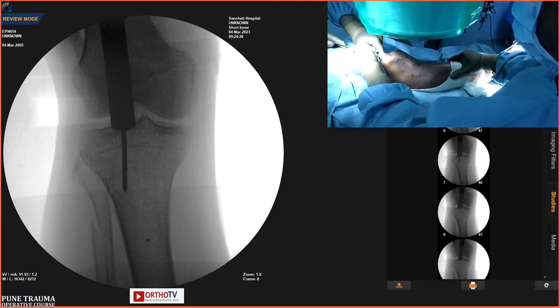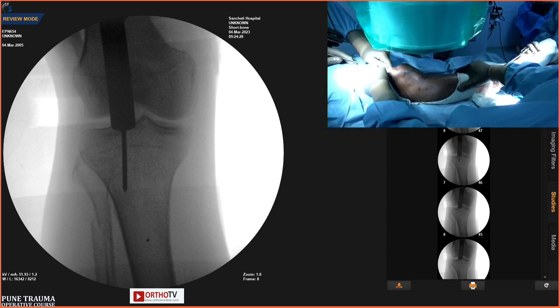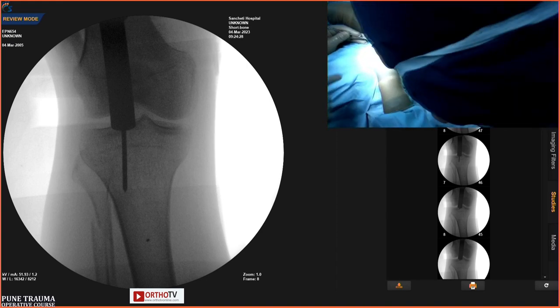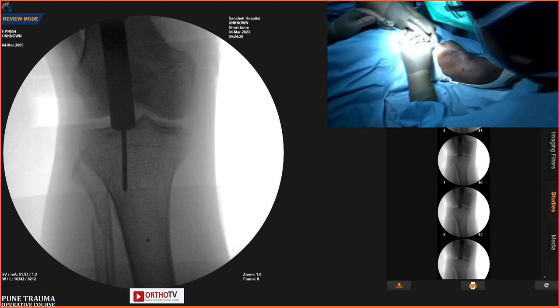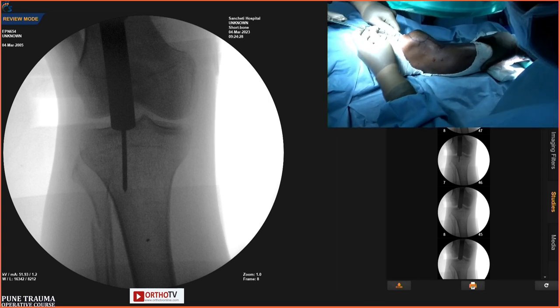I think you should go more medially. Do you want to use honeycomb now? No, we can use honeycomb. Give me another guide wire. Put it in the medial side. This is a honeycomb only.